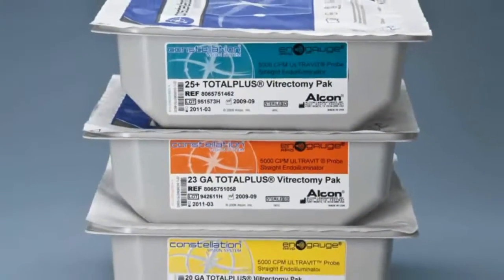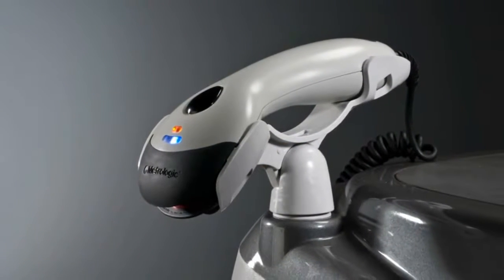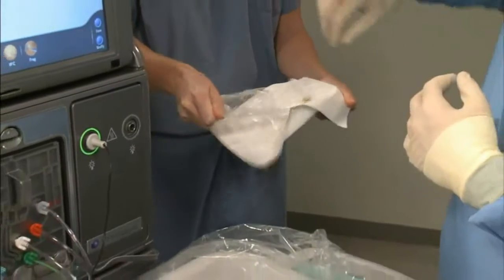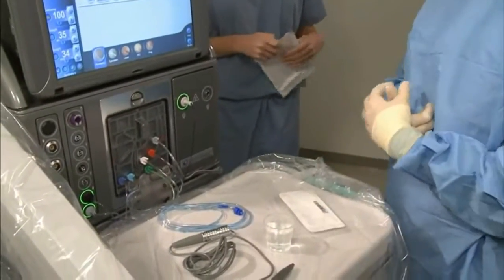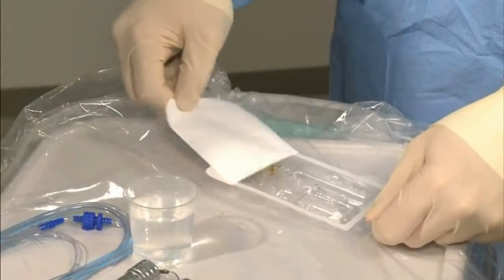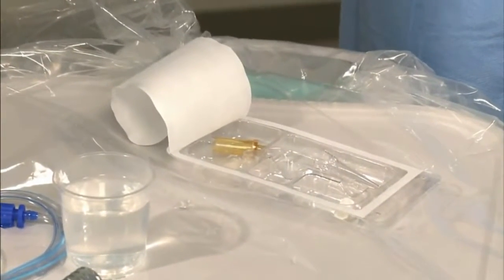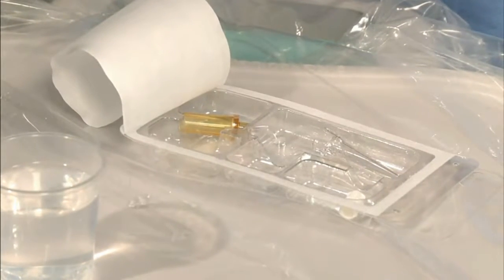Each Alcon product pack has a barcode located on the labeling. Before opening the fragmentation pack, scan the barcode on the barcode scanner. After scanning, peel apart the pack and aseptically transfer the components to the sterile field. The fragmentation pack includes one 20-gauge fragmentation tip, one tuning tip cover, and one female-to-female adapter.